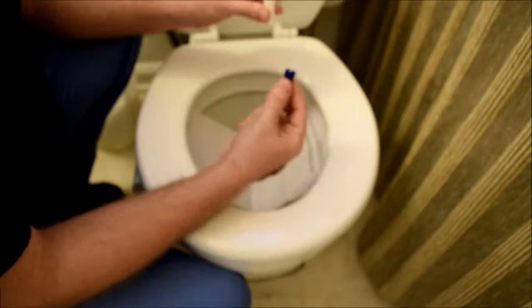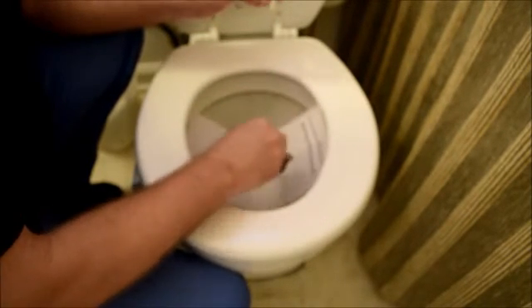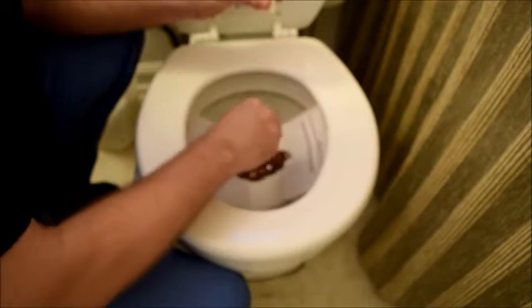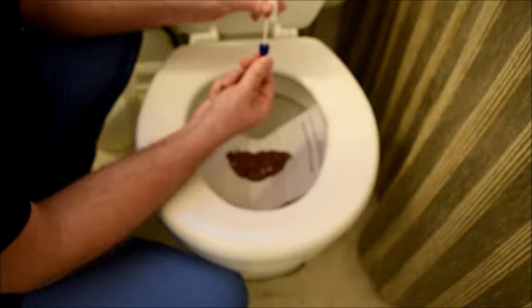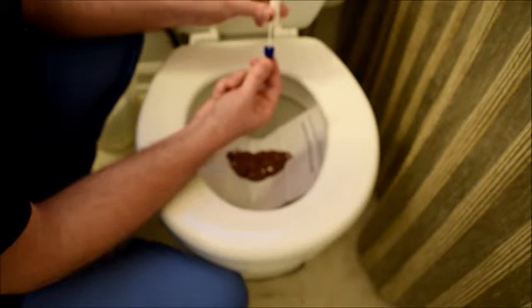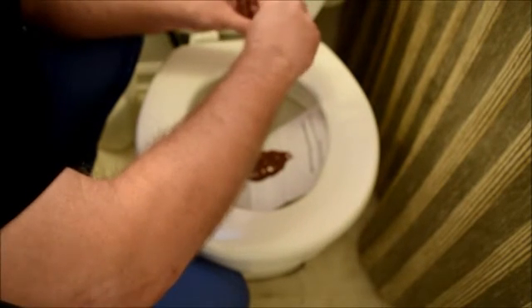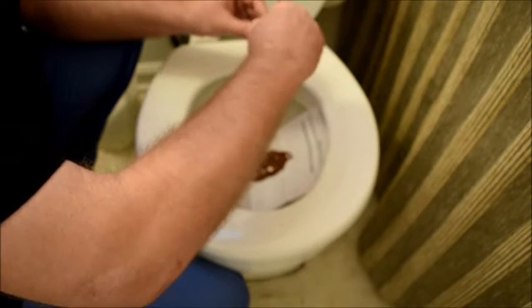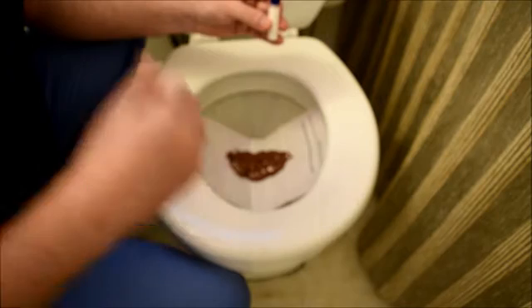I want you to take the probe, poke your sample in 6 different places, straight in and straight out. This is enough sample. You do not need more than what is on the end of this collection stick. Take the probe, put it back in your collection tube, screw tightly. Now you're finished with your collection.